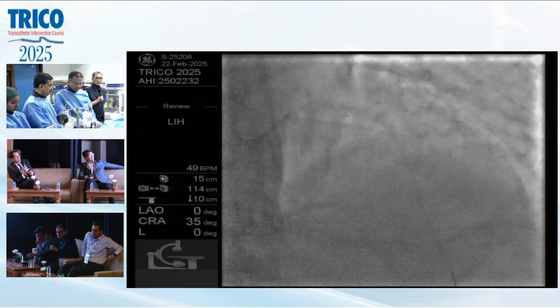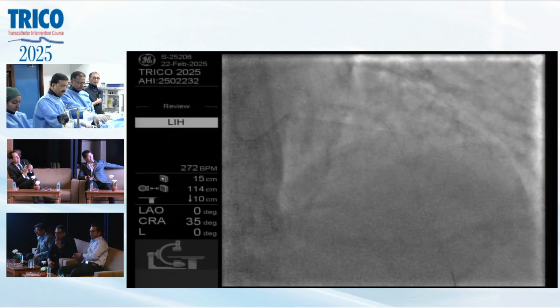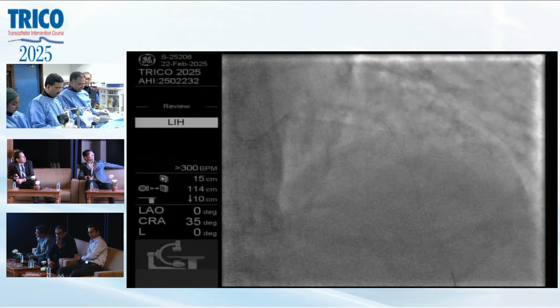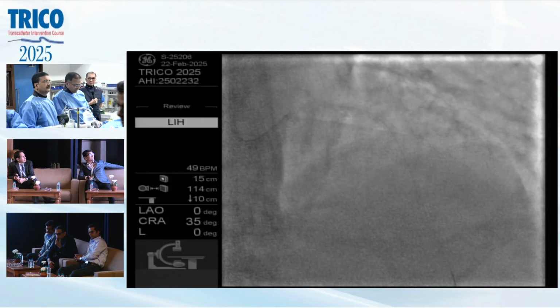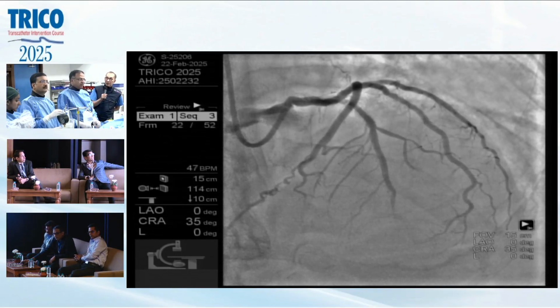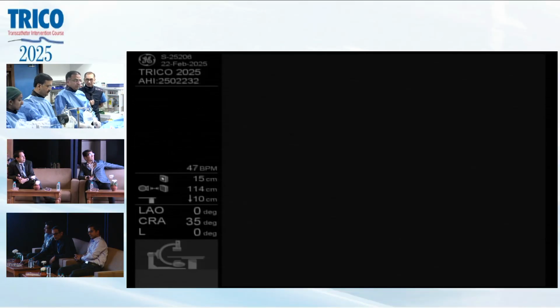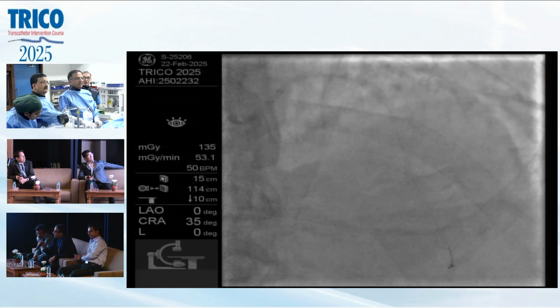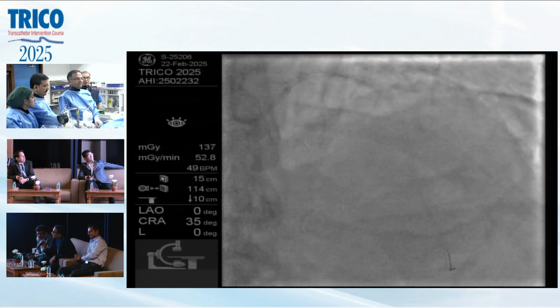So do you think the catheter of the OCT will be occlusive and you won't have contrast? Yes, we're worried about that with the EF being 35% and the right being a CTO. But I'm reassured a little bit to see that the collaterals are predominantly coming from the circ. The question is, when you put the OCT catheter into the LAD lesion, it will be occlusive, but the circ will keep the right alive, hopefully, and the circ will be having flow. So it might be better tolerated than if the right collateral is coming from the LAD.